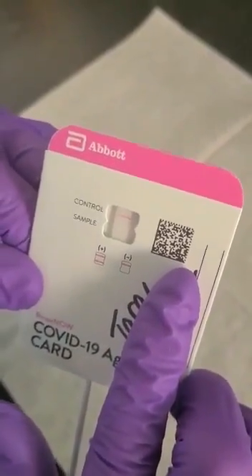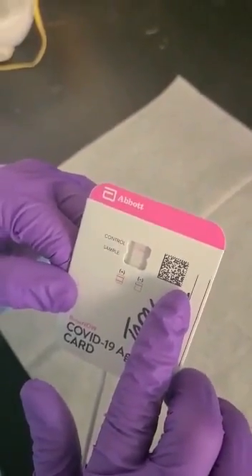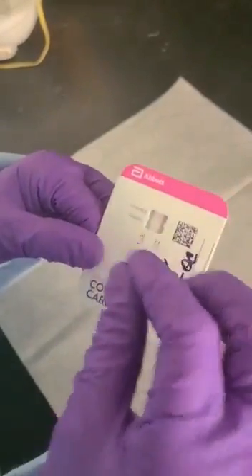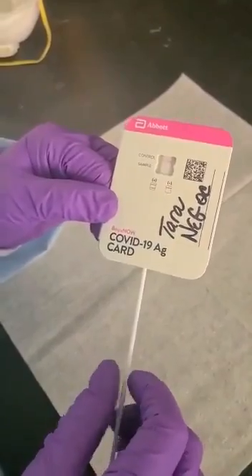Keep in mind, when you're running a control sample — an external control, which is your positive or negative — you need to place eight drops in the top well. And when you put the swab in, you turn it three times clockwise.